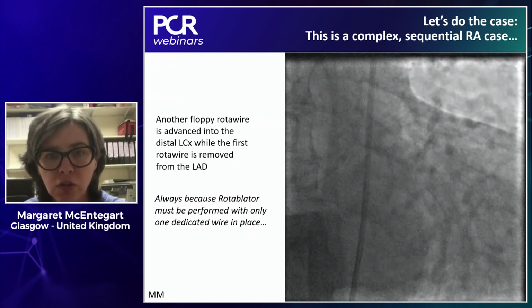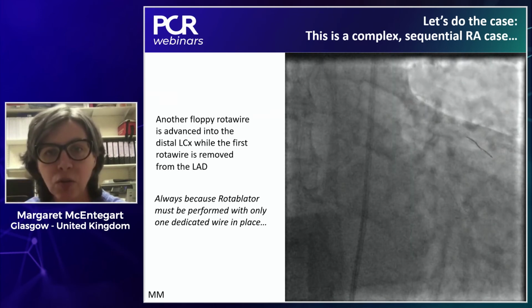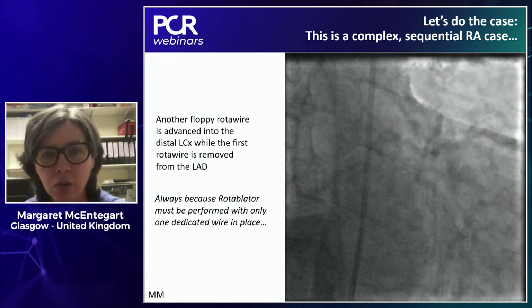And the new console is lovely because, as the burr slows, it shows you initially a yellow triangle and then a red triangle to alarm you that you're getting decelerations and you're likely to possibly stall the burr if you continue.